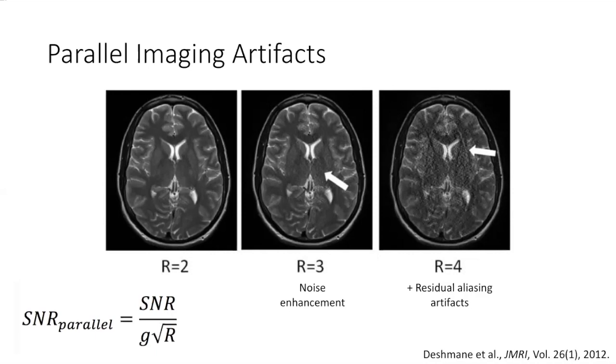It's more challenging to use parallel transmit than parallel receive. I think it's also more expensive, and for 3T brain, I don't think I've really ever seen parallel transmit used, because you don't really need to, because the B1 field is relatively smooth.